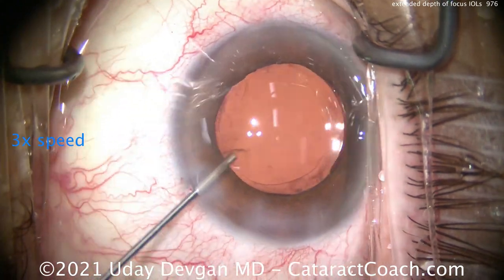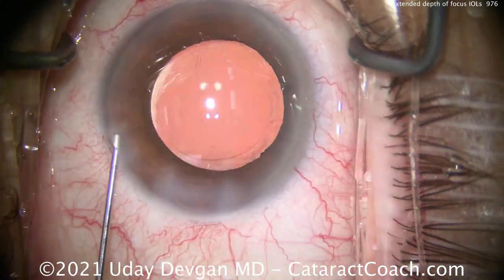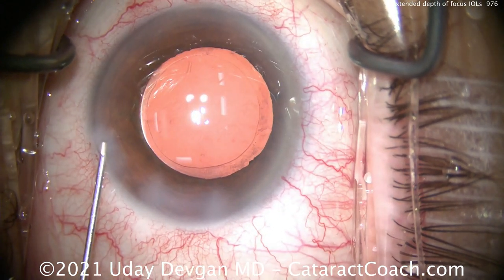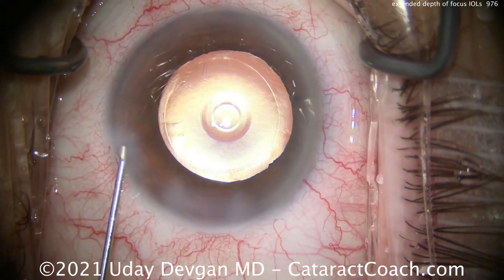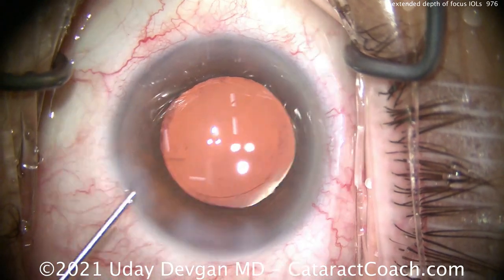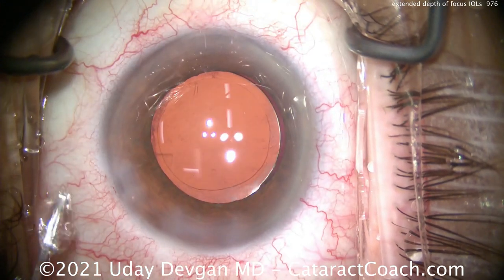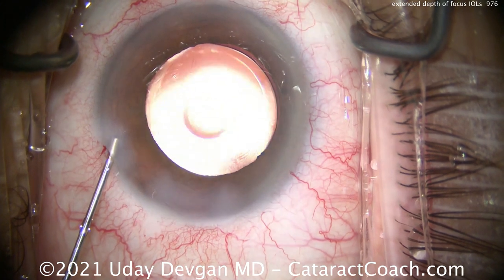There are no diffractive rings here, and because of that there is no increased nighttime haloing or rings around lights. However, you can't cheat physics. This extended depth of focus comes at the expense of a little bit of contrast. You can see that element there, and this lens needs to be centered just a little bit more — we want to get this lens exactly in the center. That looks pretty darn good.